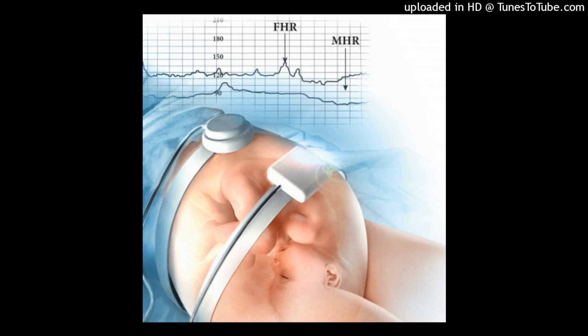Recording FHR requires ultrasound conduction gel to be applied on the Doppler surface. This gel assists in transmission of high-frequency sound waves to the level of the fetal heart where heart motion is detected. Waves then bounce back to be recorded by the bedside unit. After confirming the location of the fetal back with Leopold's maneuver, the ultrasound transducer is placed where the point of maximum intensity of the FHR can be heard.